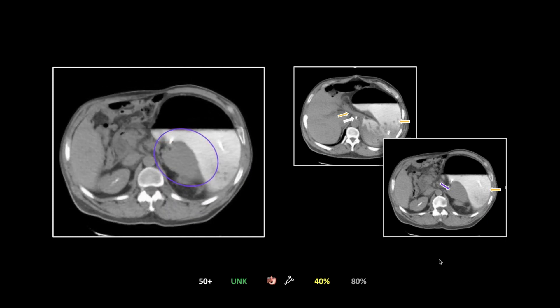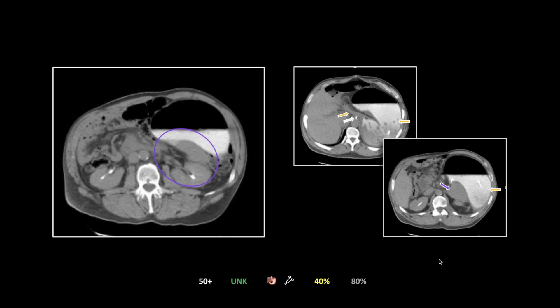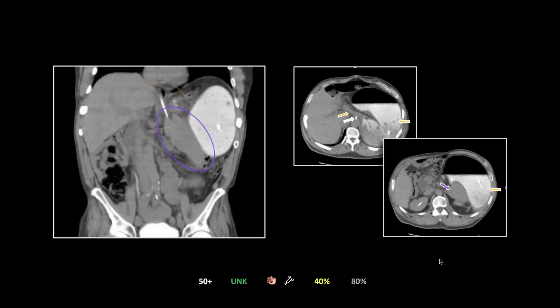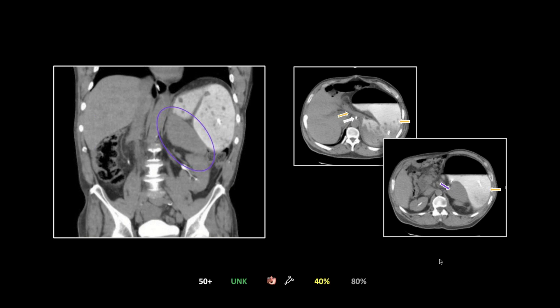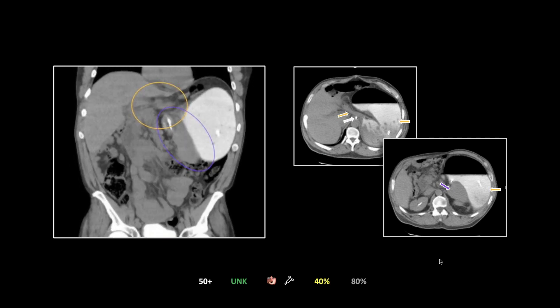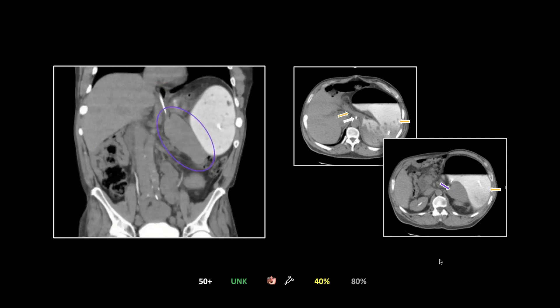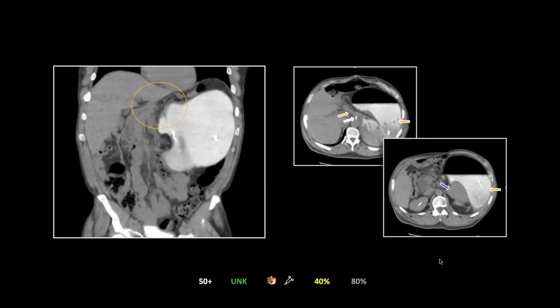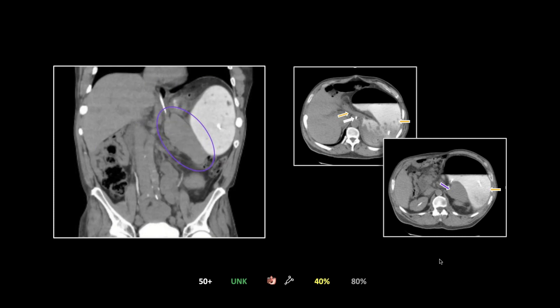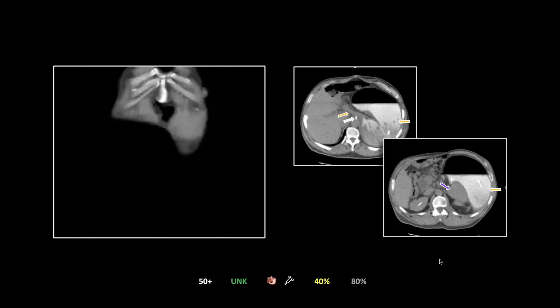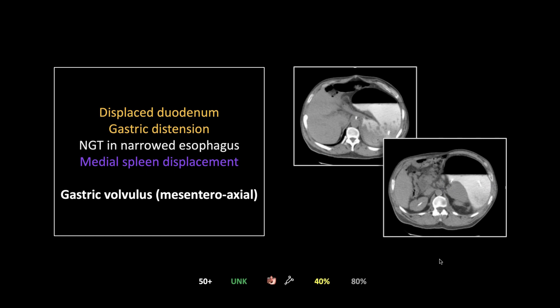That is the mesenteroaxial type of volvulus. The organoaxial type involves more of a mid-portion body twist rather than this whole torquing of the stomach with displacement of the duodenum. Watch one more time — the duodenum above the GE junction and that medial displacement of the spleen.